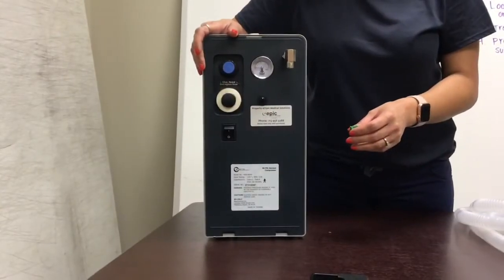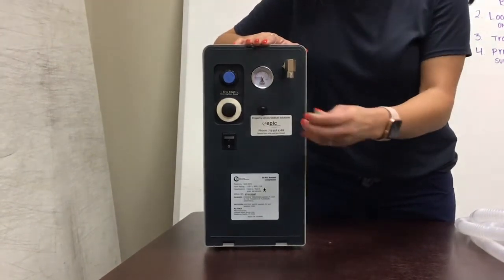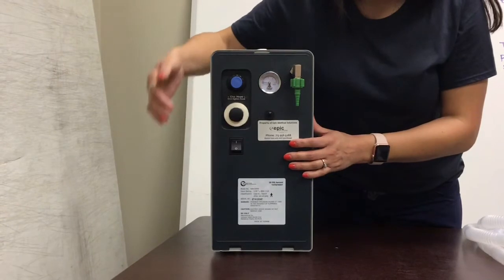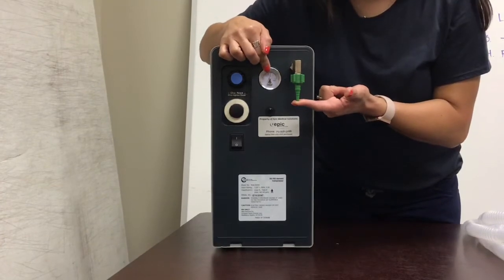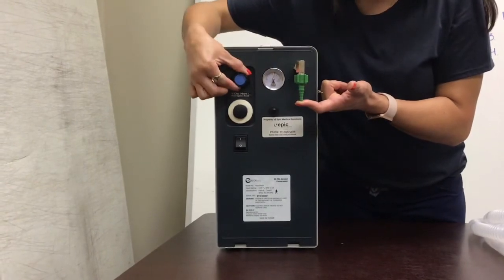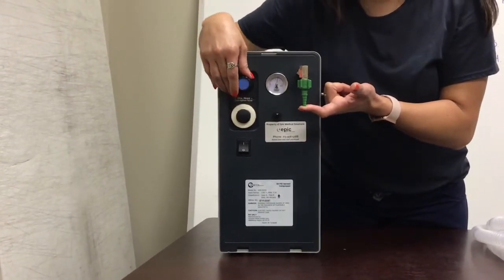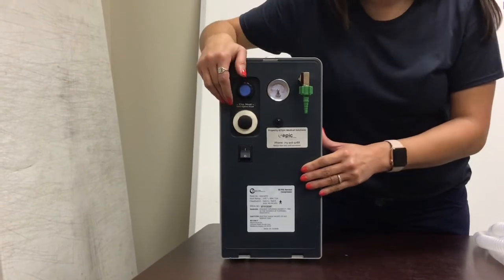This clip will be describing how to set or adjust your pressure on your compressor machine. You will be needing your Christmas tree adapter. You will then thread your Christmas tree adapter onto your connector on your compressor. You will turn your machine on. You will cover the hole on your Christmas tree adapter and check to see where your pressure is set. If your pressure needs to be changed or adjusted, you would then pull out your dial and turn to the left or right, depending on how much pressure is needed. Recommended pressure is between 20 and 30. Once you have your pressure set, now you can connect your trach collar.